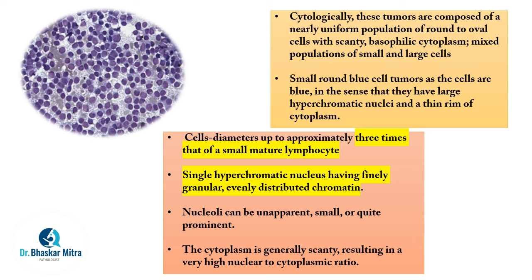I have already spoken about this. They have a single hyperchromatic nucleus having finely granular chromatin.